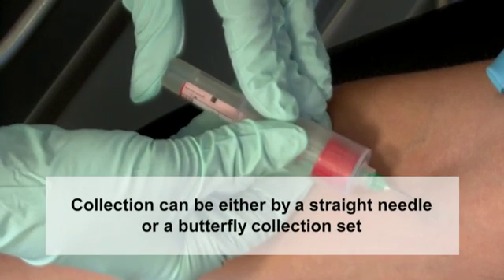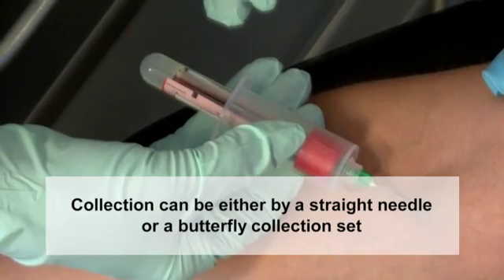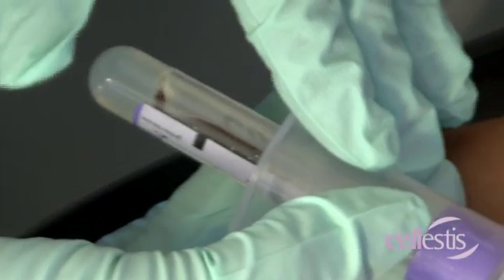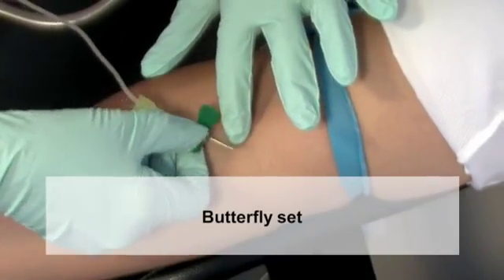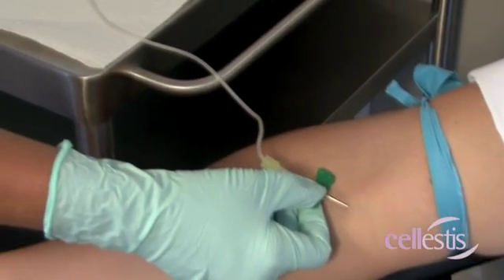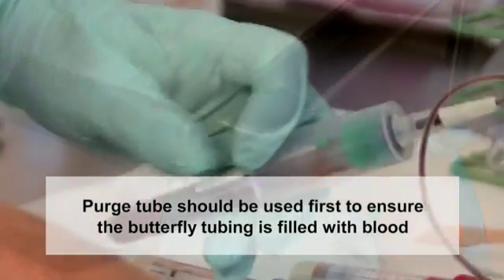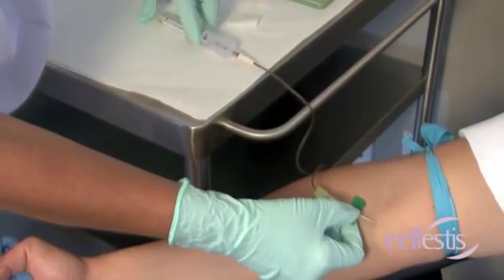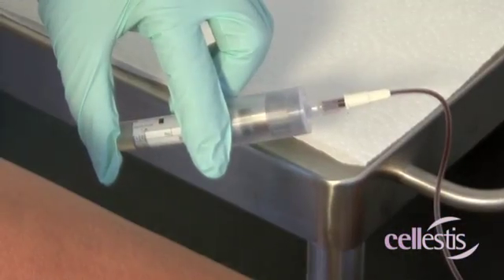Collection can be either by a straight needle or butterfly collection set. If a butterfly needle is being used to collect blood, a separate purge tube should be used first to ensure that the butterfly tubing is filled with blood. This is to compensate for the small vacuum in the QFT tubes, hence ensuring that the initial QFT tube will draw the correct volume.